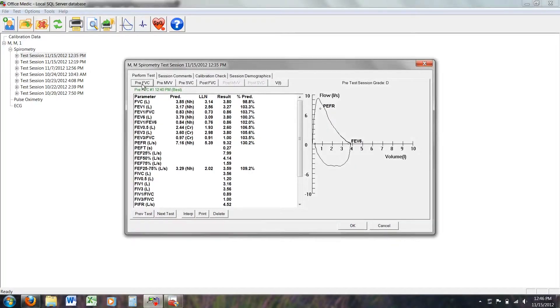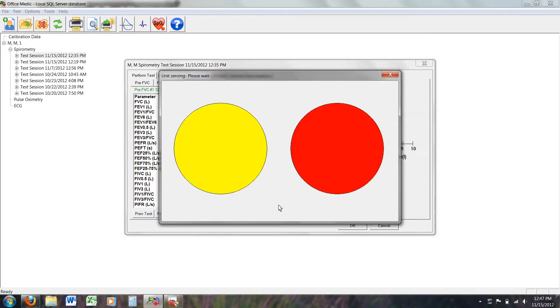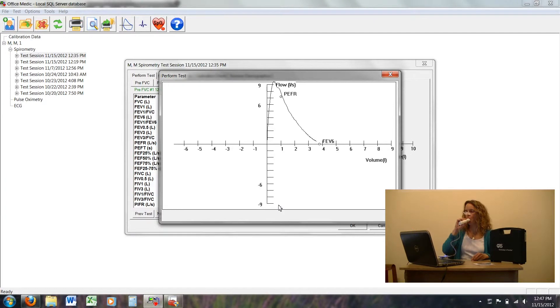I'll demonstrate how to use the Orbit while a colleague describes the procedure. Click on the pre-forced vital capacity, or pre-FVC. Make sure you are sitting upright and that your hand is not covering the mesh on the mouthpiece. Put the nose clips on and breathe normally and away from the mouthpiece while the red and yellow circles flash on your screen. When the circles turn green, inhale as deeply as you can, seal your lips around the mouthpiece and blow out as hard, fast, and long as you can, and then inhale completely, still sealed to the mouthpiece.